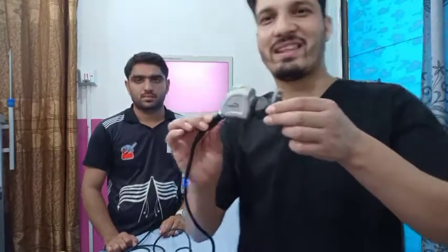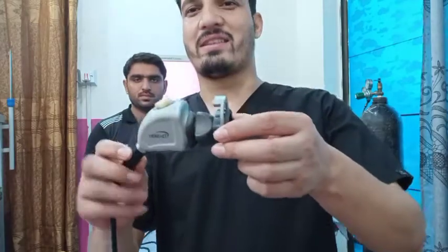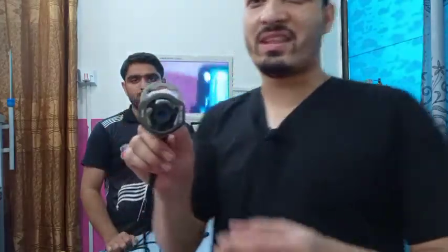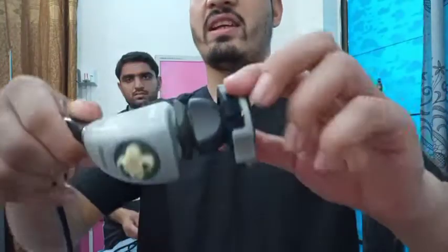Today I am here to demonstrate the basic laparoscopic camera head. This is the close-up view and this is the camera head.